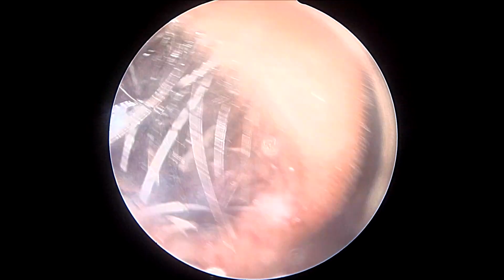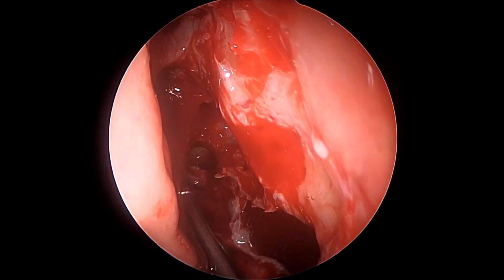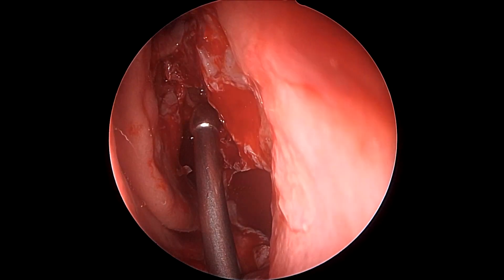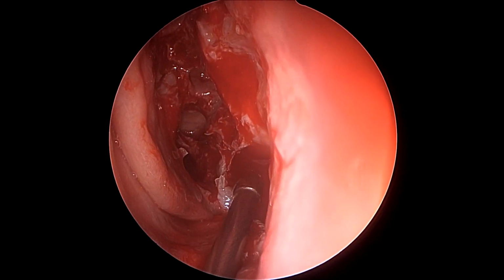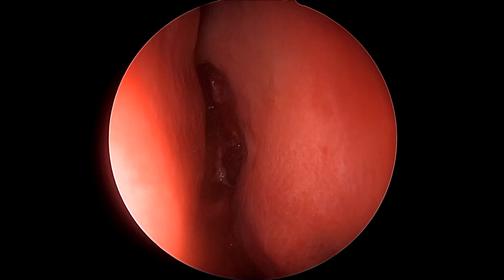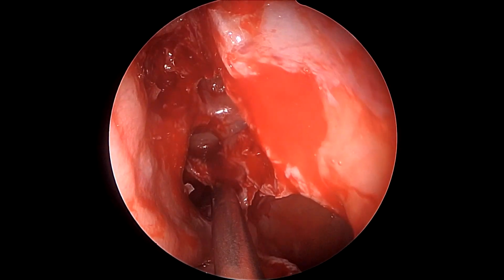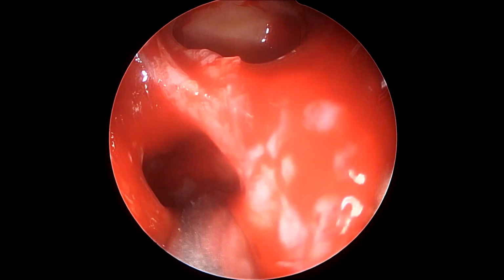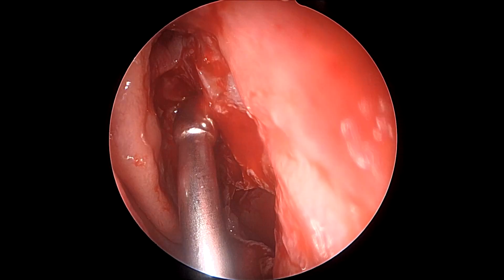Like I said, this would be followed with a formal septoplasty to give us better access in the post-operative times, and to be able to improve the patient's breathing, as well as help in the overall process of nasal irrigation, which would be hampered if the septum is not corrected. So as you can see, we could make do with the surgery with the septum, but obviously in the post-operative period we cannot control the open sinuses nor clean them in the office unless we manage this septum cleanly.